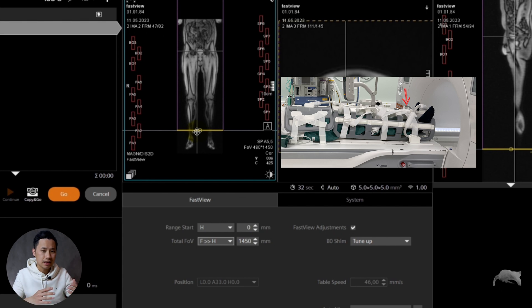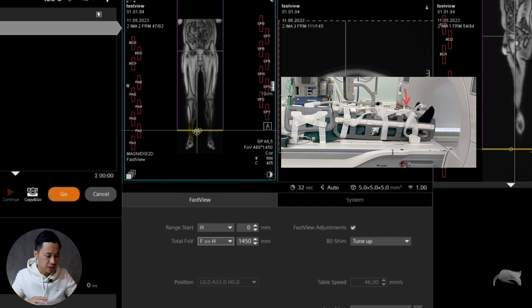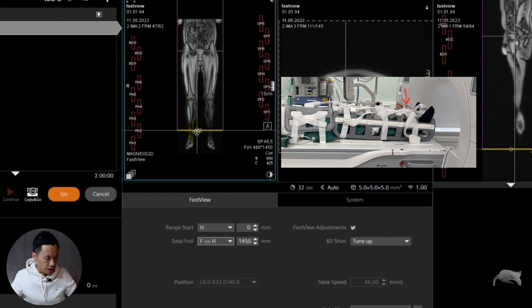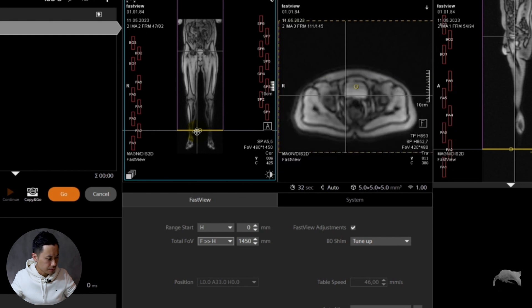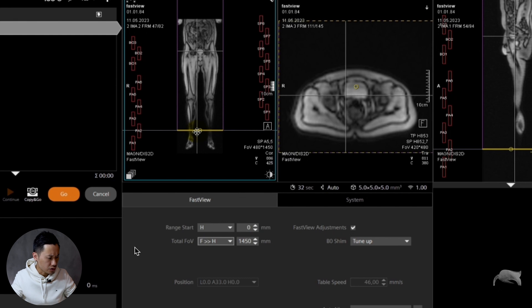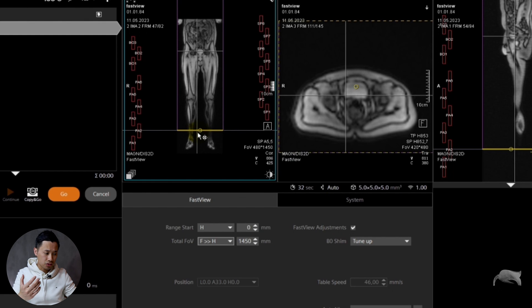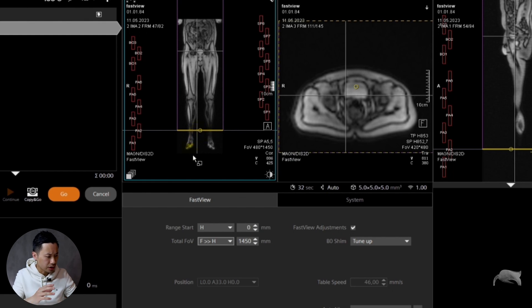It's because I did my ISO center right there, that's why zero is right there. If I put the ISO center there, zero will be here. I want to start where I want to have the whole feet, so I need to understand these two settings.